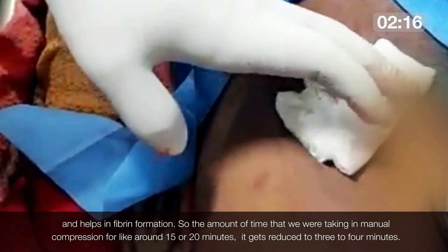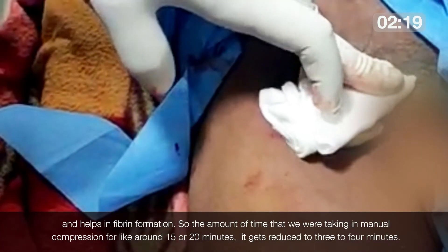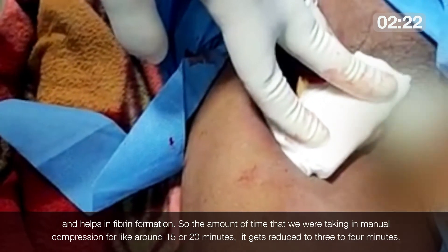The amount of time we were taking for manual compression — around 15 to 20 minutes — gets reduced to just 3 to 4 minutes.